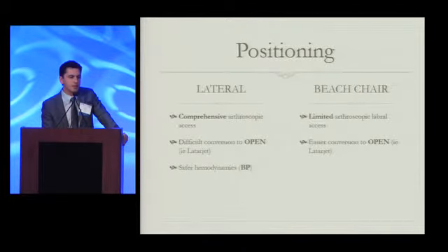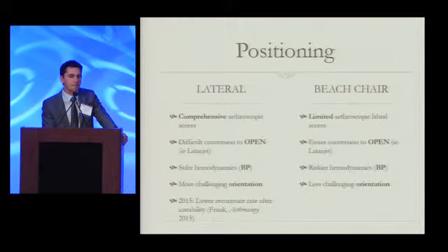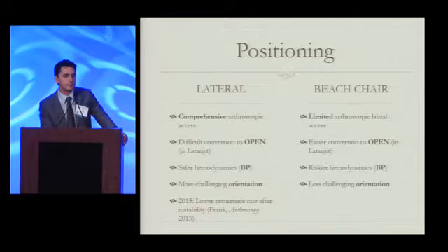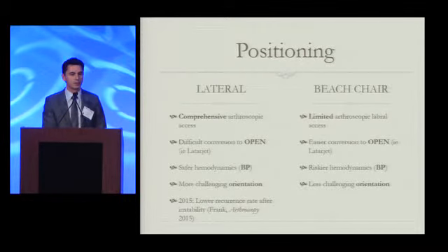Your hemodynamics are much safer in the lateral position than they are in the beach chair. It's more challenging orientation, though, in the lateral position than it is in the beach chair. Up is always up, and down is always down. Lateral, as we know, it can be quite different. Interestingly, we're learning that maybe there may be a lower recurrence rate after instability in the lateral position, but that's, at this point, still surgeon dependent, most likely.